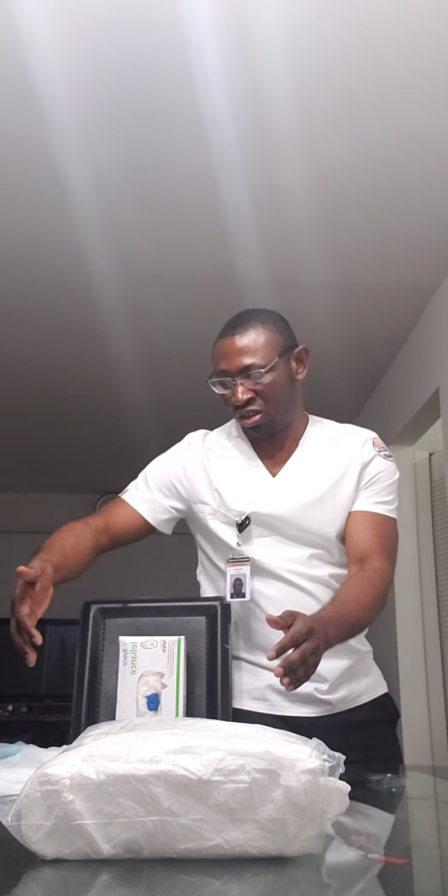After changing the pad, I position my patient. For the male patient, I have to get the legs straight so I can access the penis here. But for a female patient, I have to flex the legs and open them wide. So after doing that, I have to take off my gloves and perform my hand hygiene.